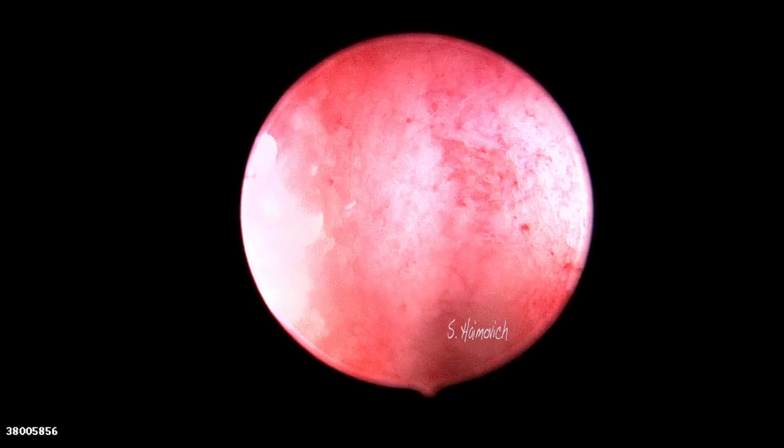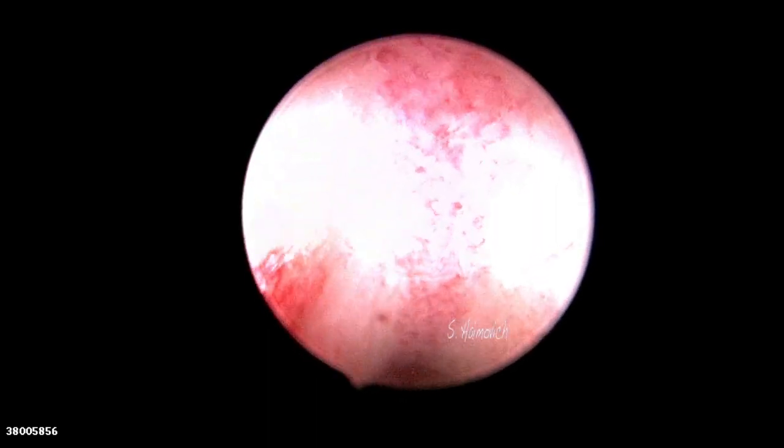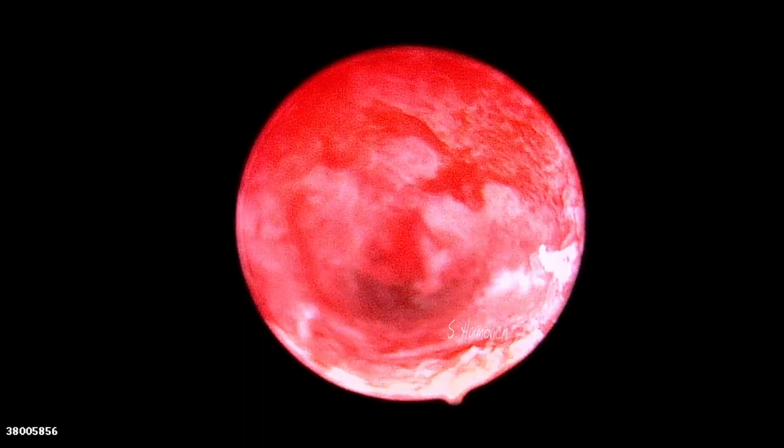We present a case of unicornuate uterus. Notice the very narrow cavity with only the left tubal ostium. The procedure was performed with diode laser, a very precise energy that cuts and coagulates simultaneously.